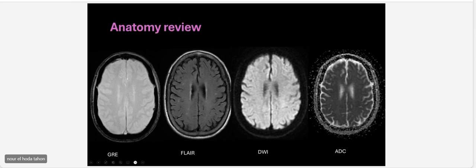But what if I see this signal in a female, 30, 40 years old, and she has weakness? Multiple sclerosis? Yeah, excellent, exactly.